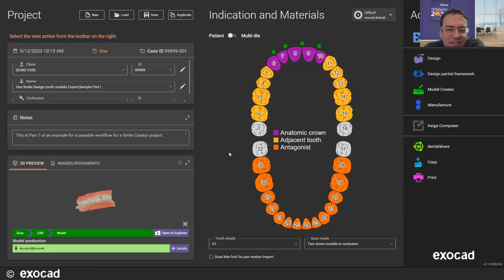Yes, we have no more questions. I think we're good, Dan. Oh, right, then one last question. Do we recommend connecting like a bridge for mock-up workflow?